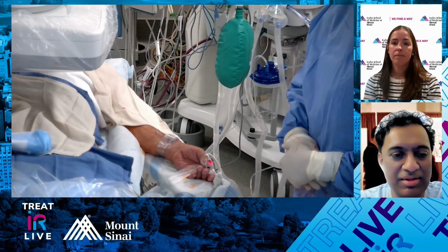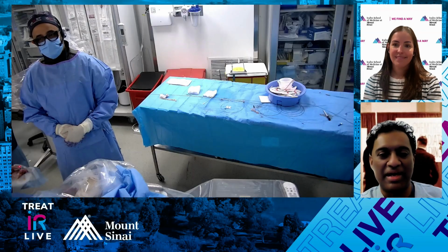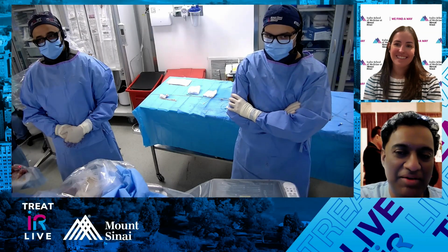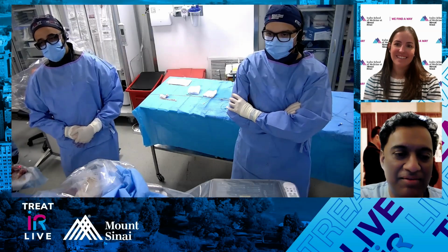This is an awesome case. Thanks, Goegy. I liked the combination of the large coil mass and then the intermediate coils. I guess it used to be the largest coils through a microcatheter, but now you have the intermediate, the large, and the small, the LP. So nice to have. Great case.